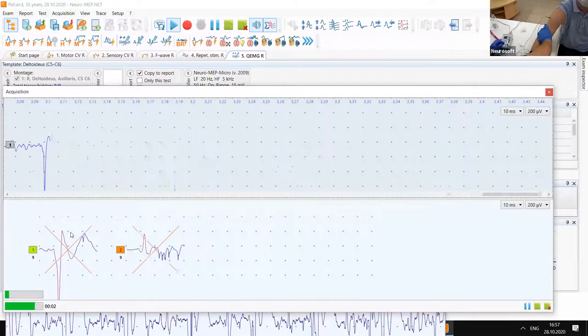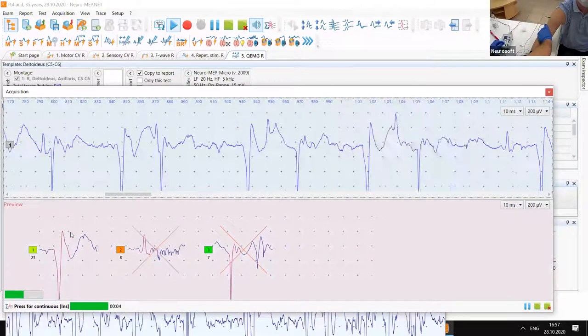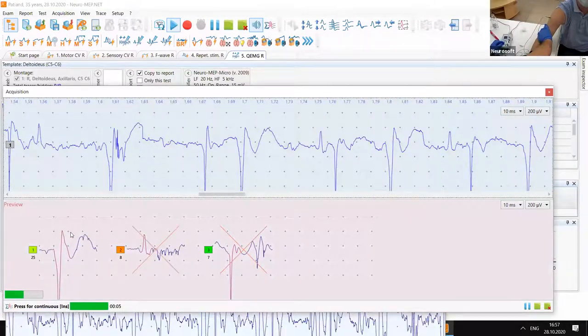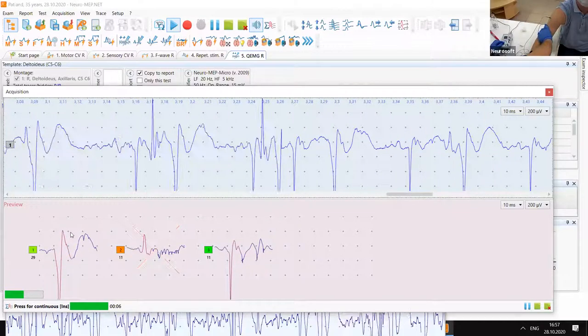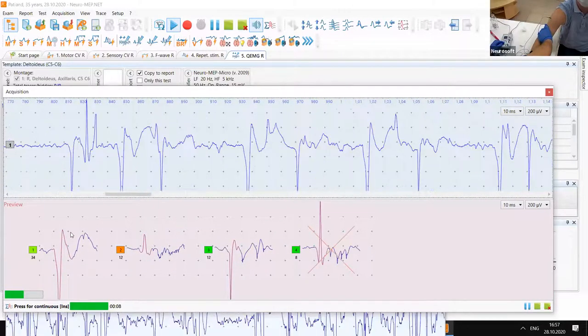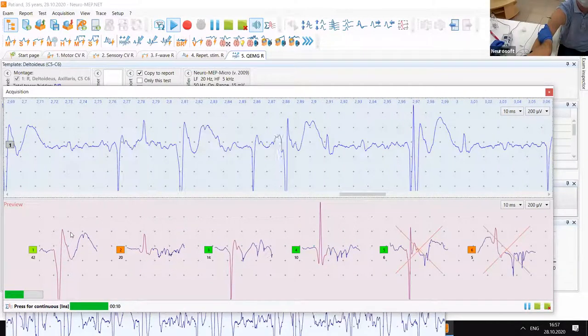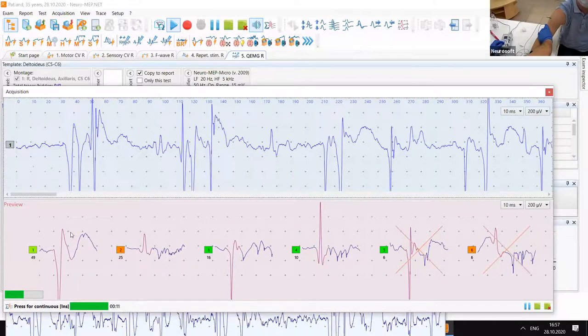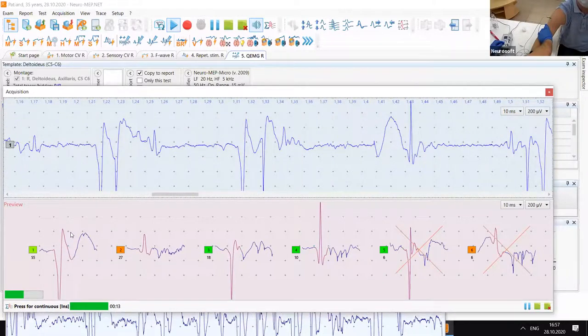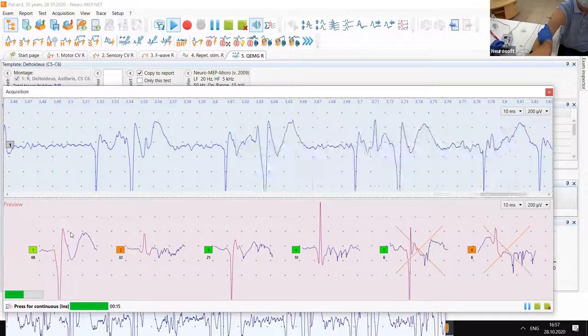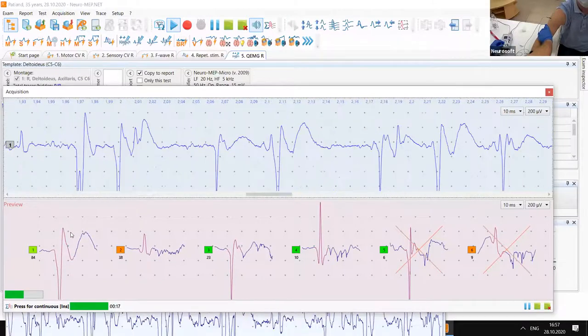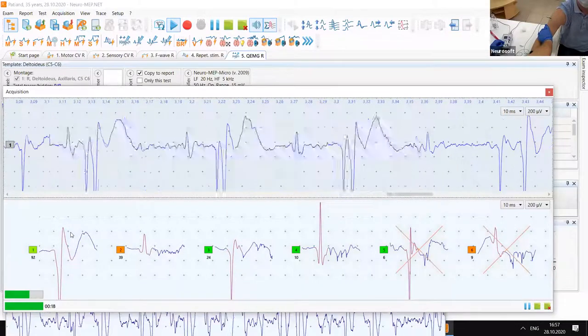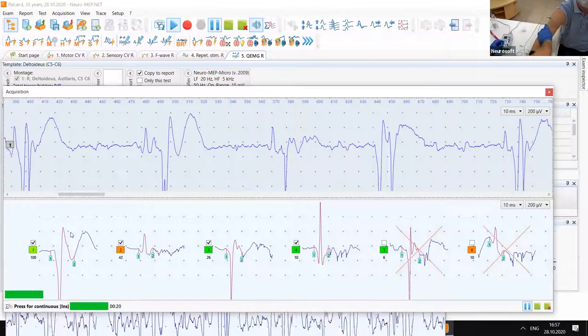You can see several motor unit potentials from that point. Usually from one position of the needle, we can get two or three motor unit potentials. Okay, relax.